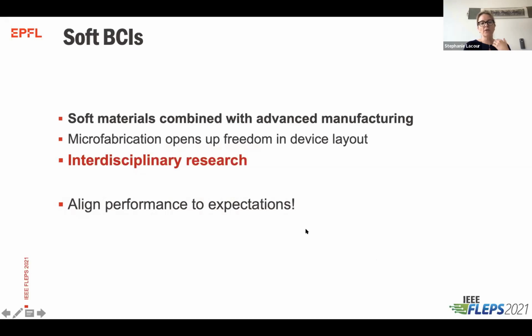Of course, this is very interdisciplinary research. You need to have inputs from many players, so this is a highly collaborative work. And also what we've learned over the years now is that you really need to align the performance of your device with your expectation. And especially when you push towards translational application, you really need to have high reproducibility and stability of your device from one run to the other.